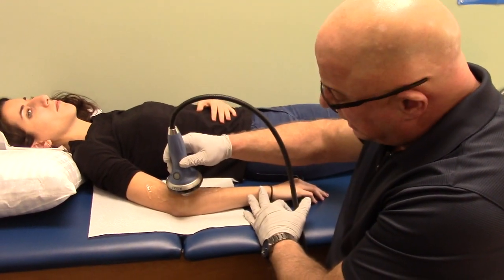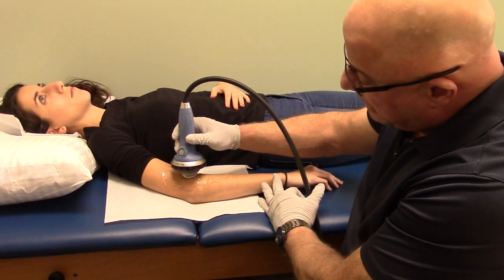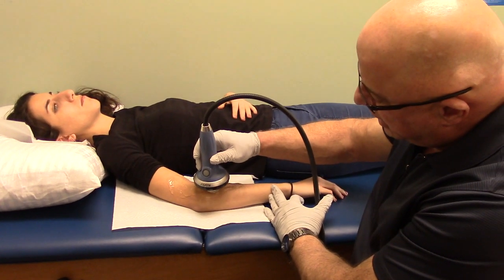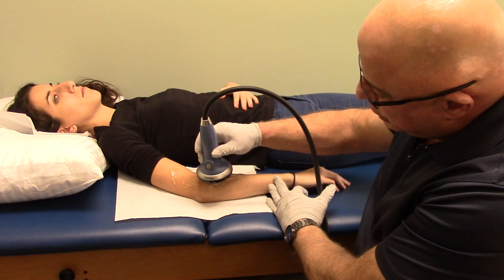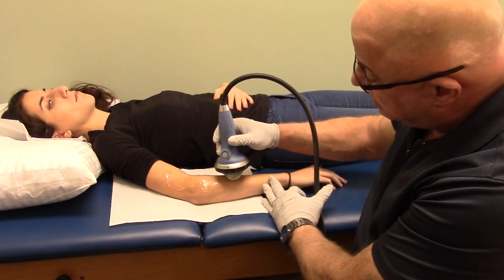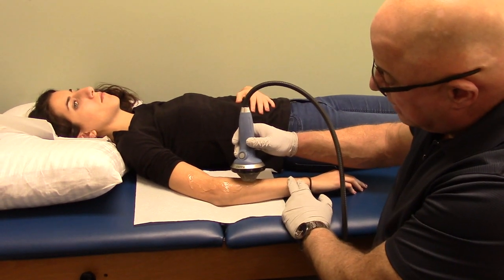That's why it becomes so effective. Keep in mind, this is not an ongoing treatment. The number of treatments is usually about 7 to 10 per area, and then we follow up with the patient 2 to 6 months — once a month — after the last treatment, to make sure things are improving and where the patient is at.